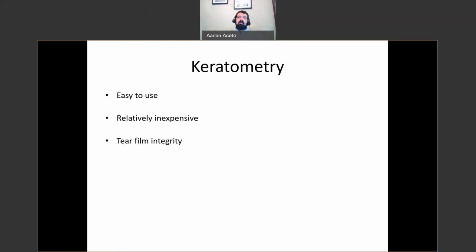And so I'll be looking at the keratometer, and the mires, the reflections I'm looking for, can sometimes get irregular and wavy while I'm looking at it, and worsening as I'm looking at it. That's generally a byproduct of the tear film literally evaporating, the eye no longer being reflective because the tear film has broken down, and I'm not getting good values. Well, even if I'm not getting a good measurement, that's very useful to note the quality of the tear film, and that's important.